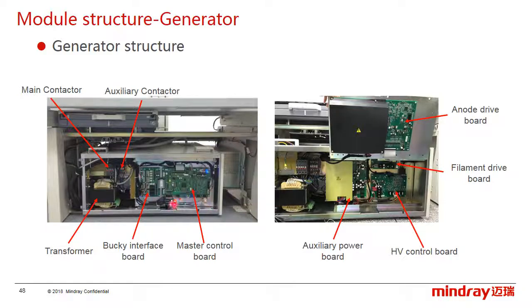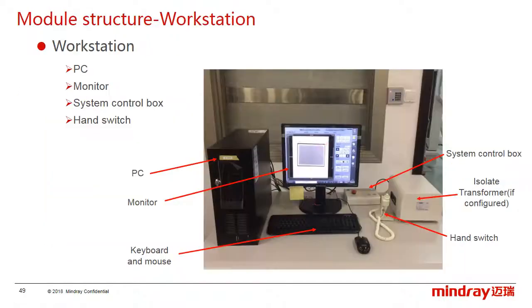And turn over the master control board, we can see the anode drive board, the filament drive board, high voltage control board, and the auxiliary power.